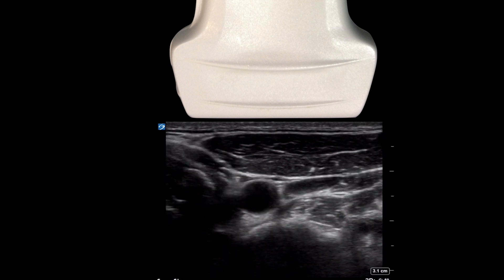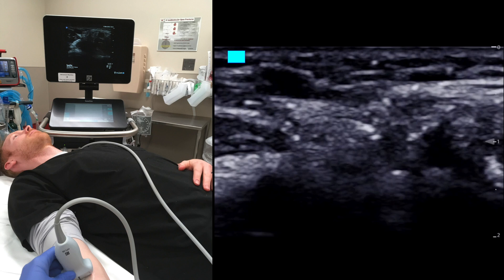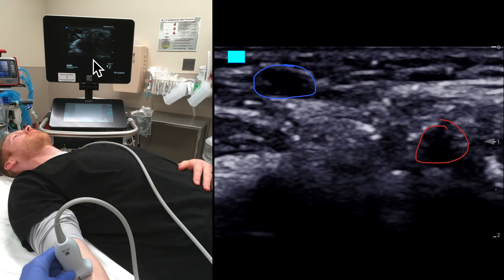In this particular video, we're looking at an IJ and the carotid. If we set up the room, this is looking at the median cubital vein, which is right here, and there's an artery down over here. You notice that the machine is across from the patient but in direct line of sight with the vessel I'm going for. I usually assess which vein to go for first, get all my machine settings correctly — the depth and everything — save my pre-attempt images or videos, and then set up the machine across from the patient in direct line of sight for the best success.